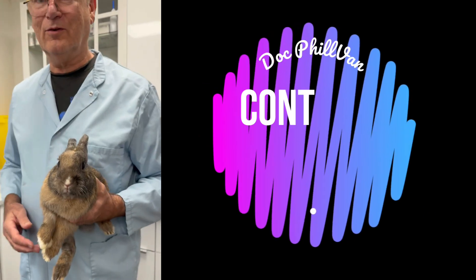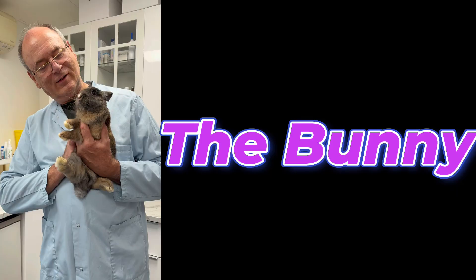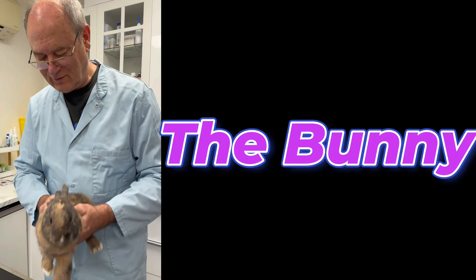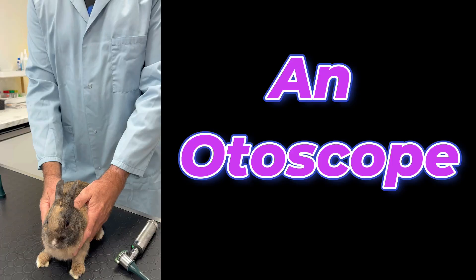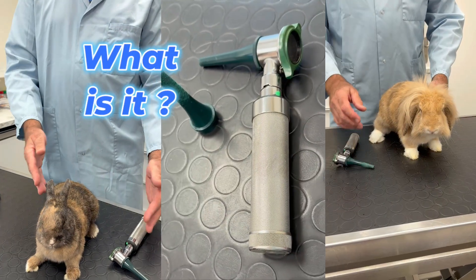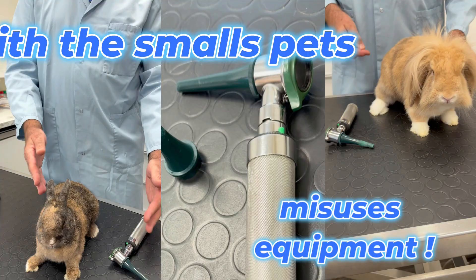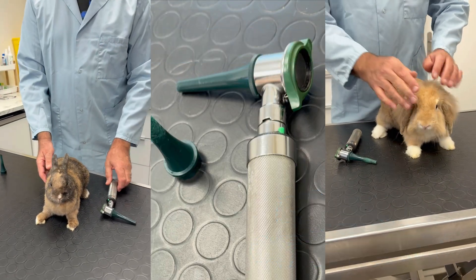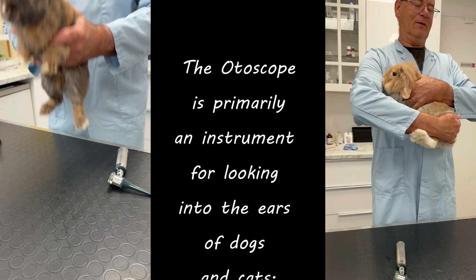I'm going to show you how to examine this little rabbit's teeth. Here is a little rabbit, and we have to look at all its teeth. To have a look, I'll use our otoscope. With the bunny, we repurpose equipment. The otoscope is originally an instrument used to look inside the ears of dogs and cats.